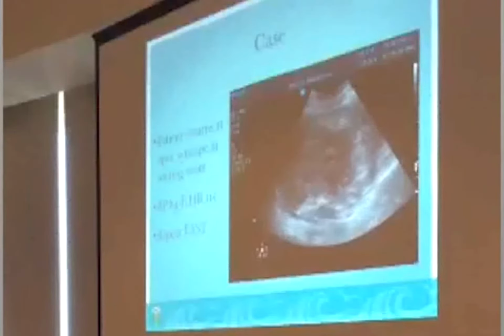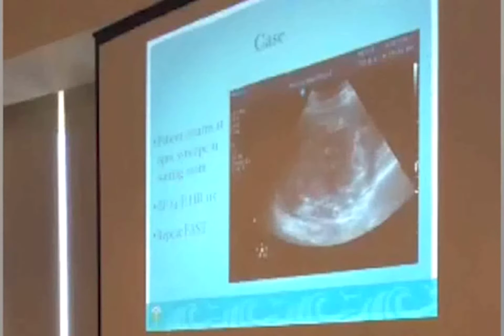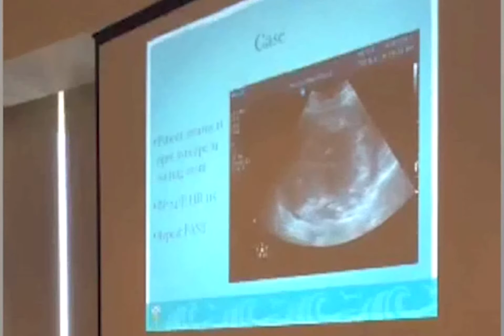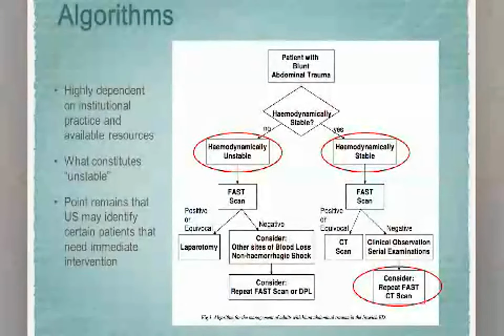And this was his spleen. So it is not within the scope of your ED practice or FAST exam to diagnose splenic lacerations and ruptures. But if you see a bunch of blushy blood and abnormal material in a spleen, and you've seen a bunch of other ones that don't have that, high index of suspicion that you have an injury. And these don't always leak. And these don't always become hemodynamically unstable right away. So look, and like I said, the machine will start to teach you. You don't have to know exactly what you're looking for, just look every time. And repeat your FAST. And that's kind of the point of this slide.